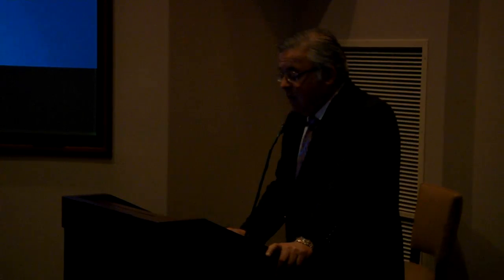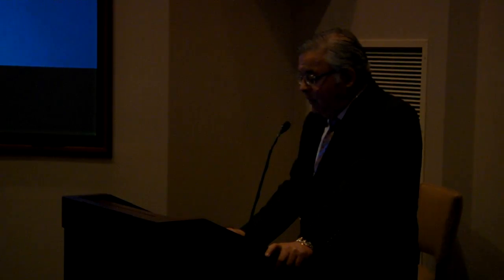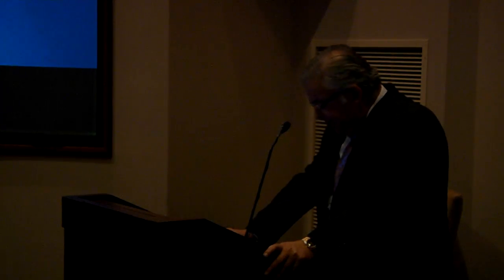In the secondary cytoreductive setting, imaging is attempting to distinguish localized from multifocal disease. The more disease that I can find, presumably that has an effect on the nature of the conversation that the oncologist or the attending surgeon is going to have with that patient, and presumably an effect on what they do in those patients. Like I said, I did not drink the Kool-Aid.